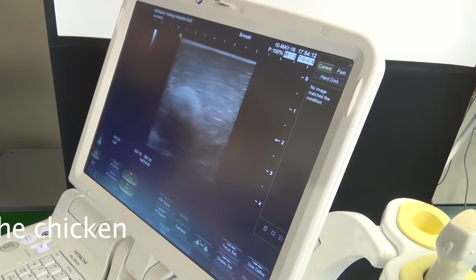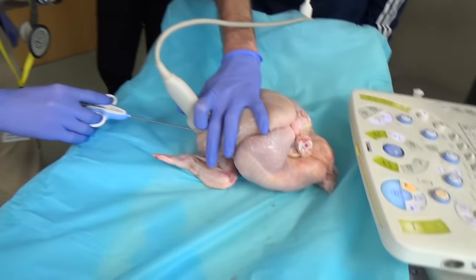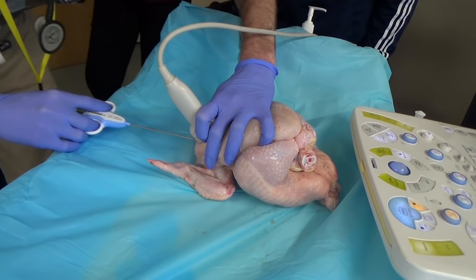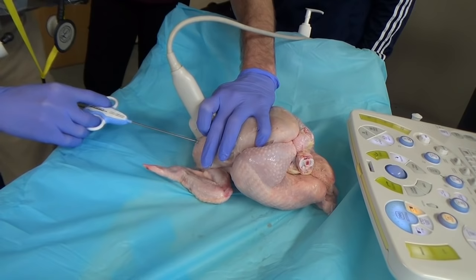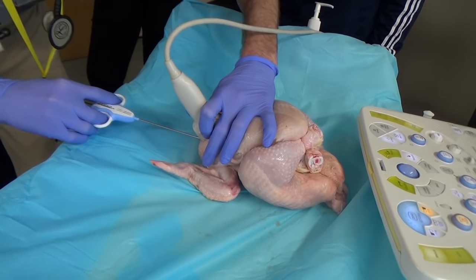This is exactly what happens with a human being — you have to push really hard and it distorts the tissues as you do it.